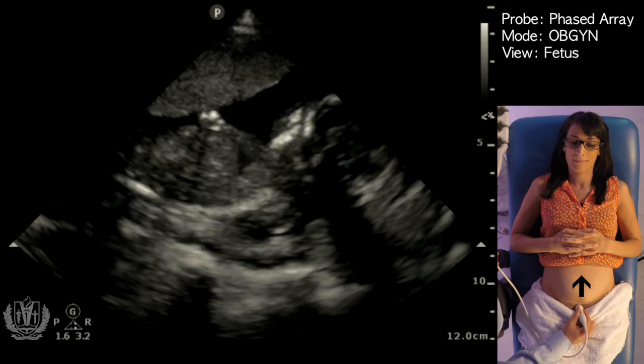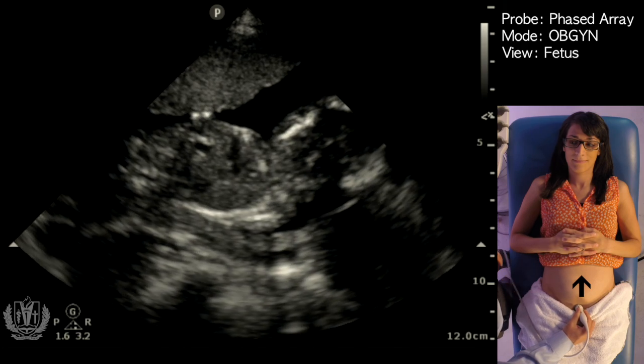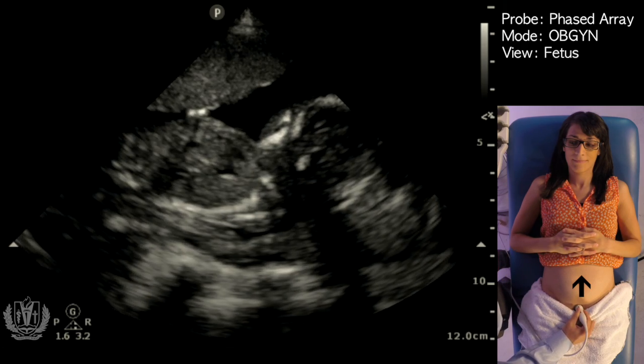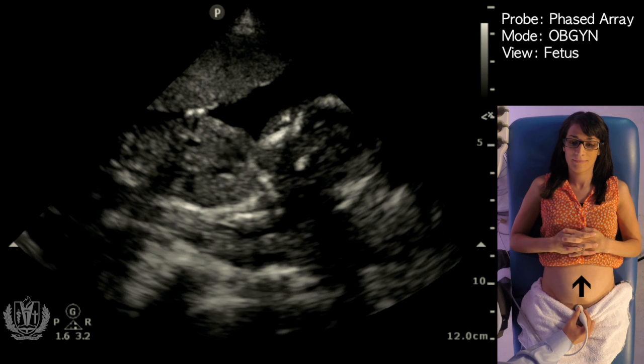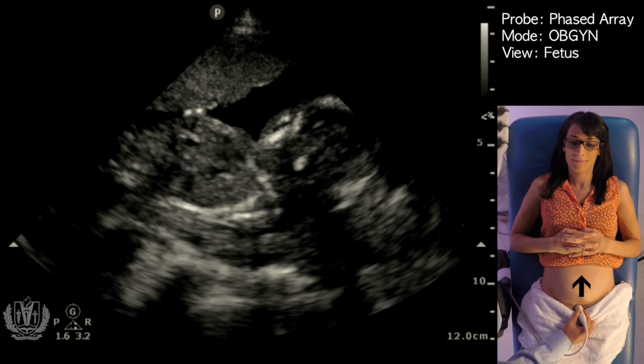In the middle of the screen is the fetal heart. When you identify the fetal heart, you can actually measure the fetal heart rate using M-mode.